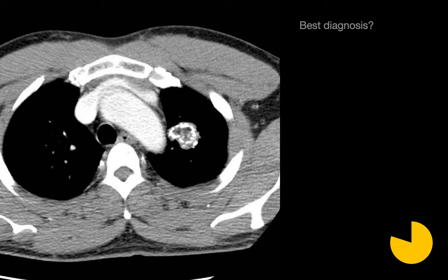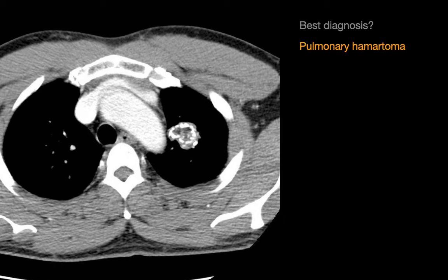What's your best diagnosis for this lung nodule? The imaging features of this left upper lobe lung nodule are notable for not only calcification in a peripheral distribution, but a few small regions of fat attenuation within it. We can compare the darkest regions of this lung nodule with the subcutaneous fat in the patient's chest wall and see that they are similar in attenuation. The presence of macroscopic fat within a circumscribed lung nodule is pathognomonic for a pulmonary hamartoma. Pulmonary hamartomas and pulmonary chondromas are two benign lung neoplasms that are sometimes confused with each other.